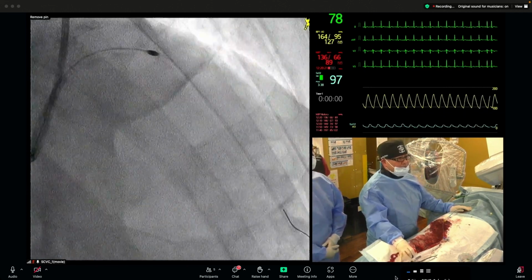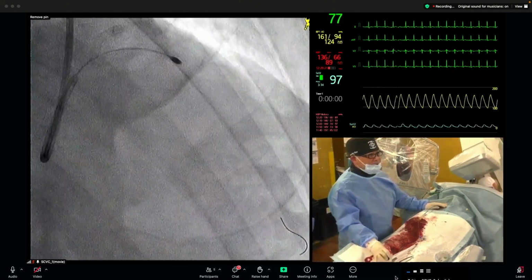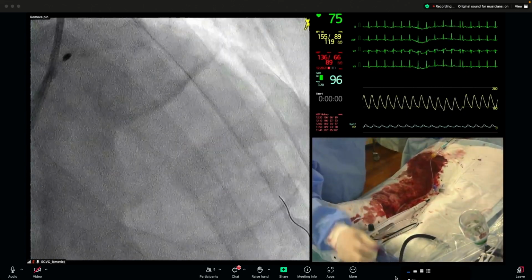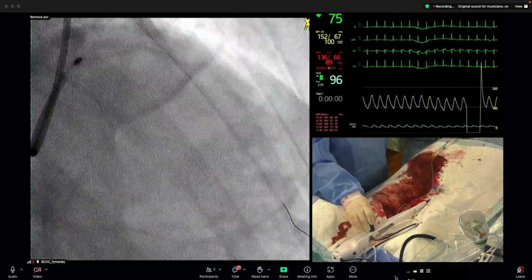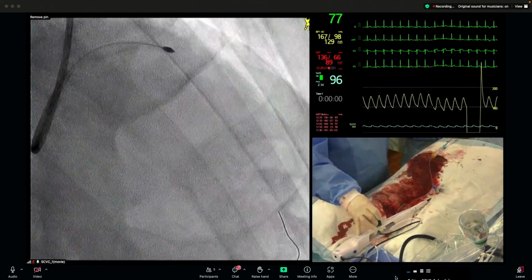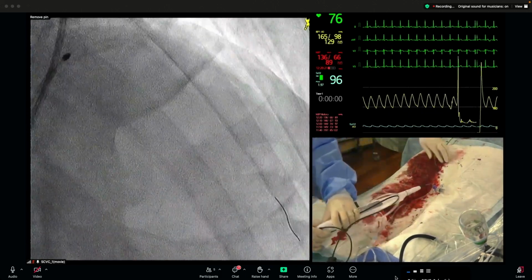Dr. Kashima, this is Yoshimachi speaking. I agree with not using the OAS because I'm afraid of distal embolization with a big burr. If you use a 2.0 millimeter burr or 2.25 millimeter burr, it needs an 8 French guiding catheter, so there is a high risk of bleeding.